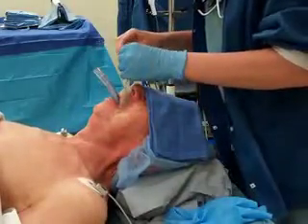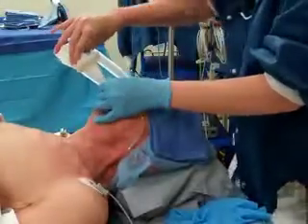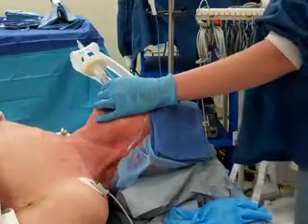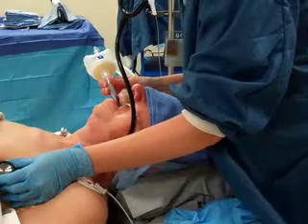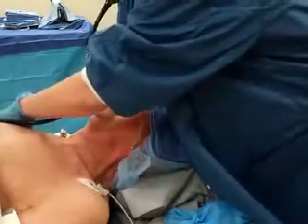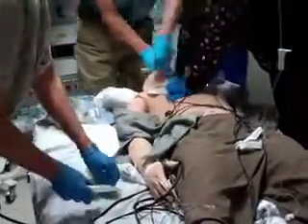After placement, inflate the cuff and then connect the device to a positive pressure ventilation system. Confirm proper placement by auscultation of breath sounds. Auscultation of breath sounds should take less than 5 seconds, and placement of the laryngeal mask airway during resuscitation should not require interruption of CPR.